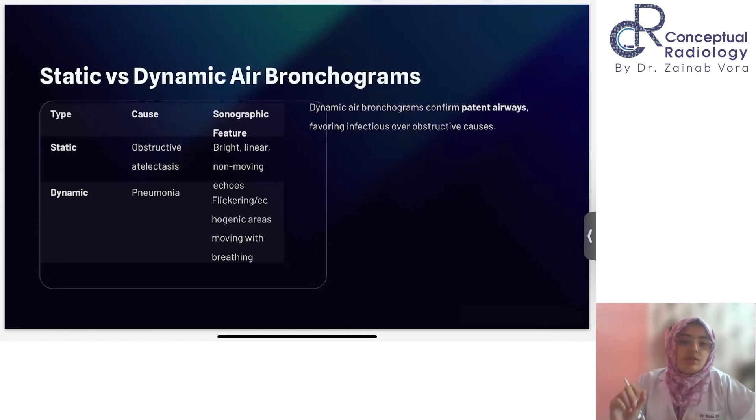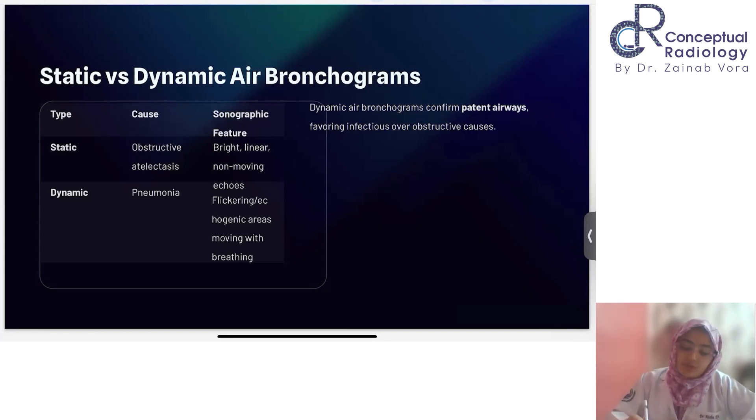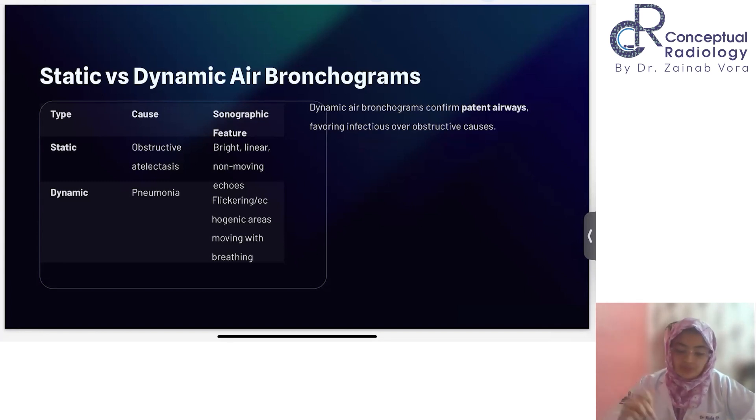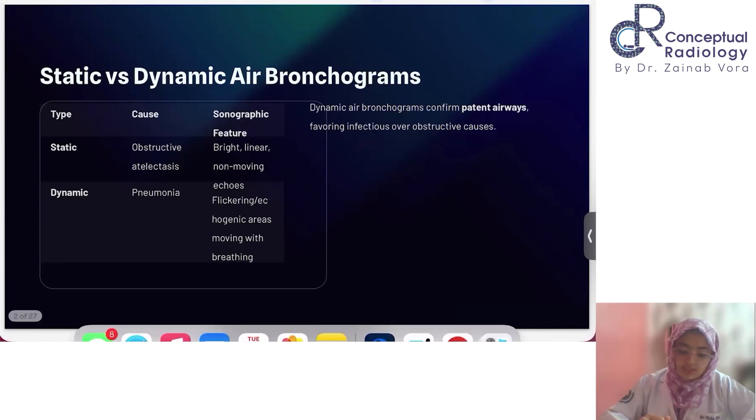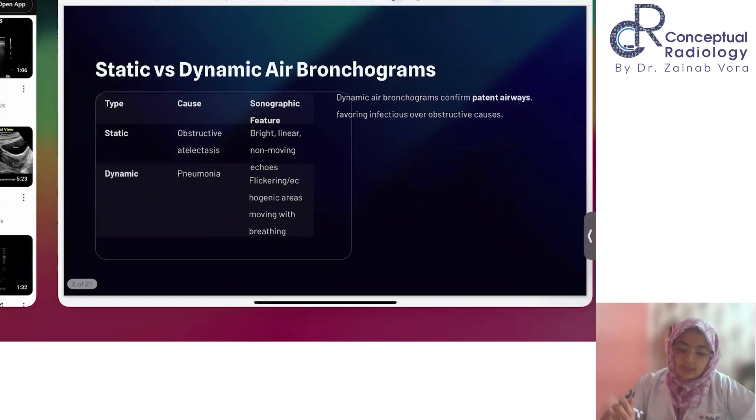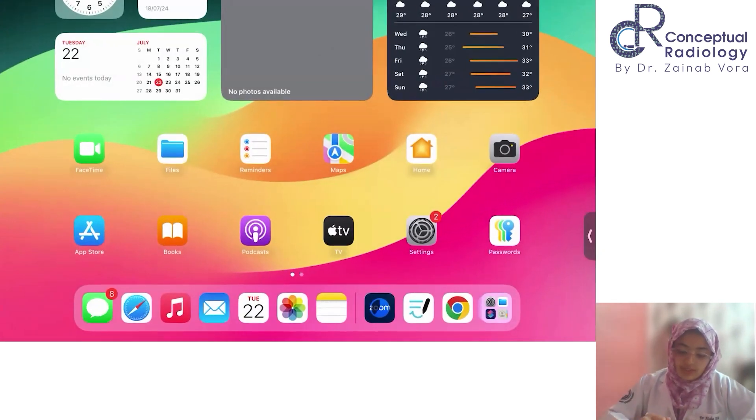Dynamic air bronchograms are going to favor infection over obstructive etiology. Let's watch this with the help of a video.